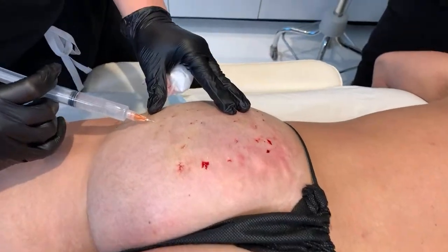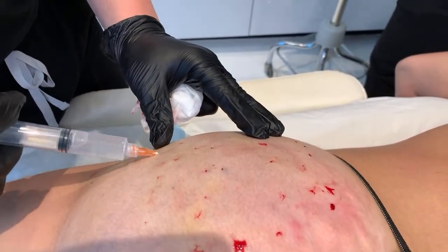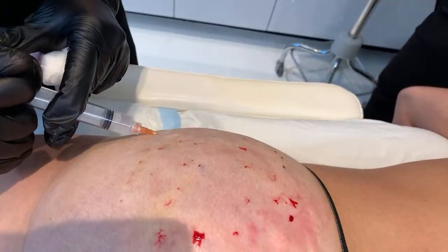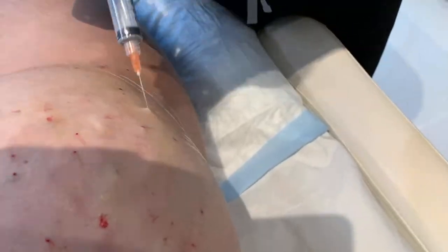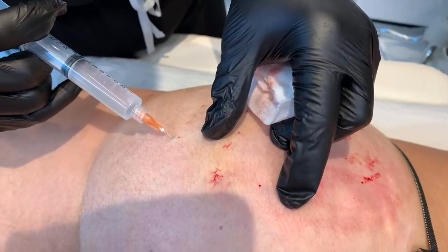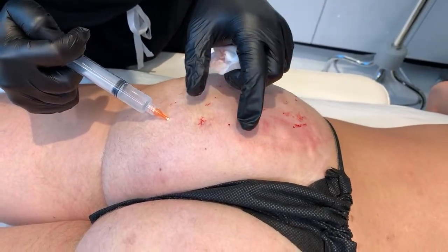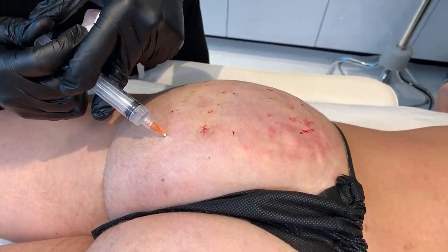The other thing too is this is great for cellulite. Most guys don't really have cellulite, but a lot of women do. This is why we do Sculptra. It builds in here, and then again, remember the fat is integrating right now. It needs blood supply to survive. So here we are injecting the Sculptra as almost like a nutrient to supply. I used to even combine this with PRP and stem cells as well. Everything adds up, you know, it gets expensive. So let's just try at least the best that we can get for him now with boosting.